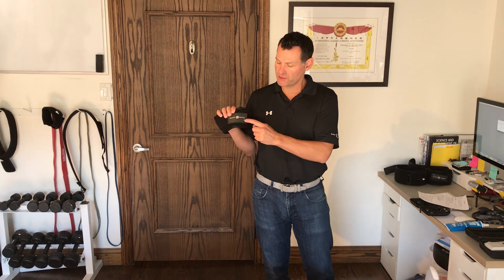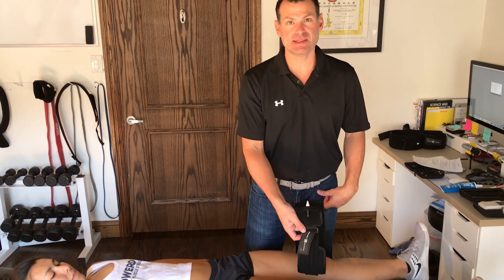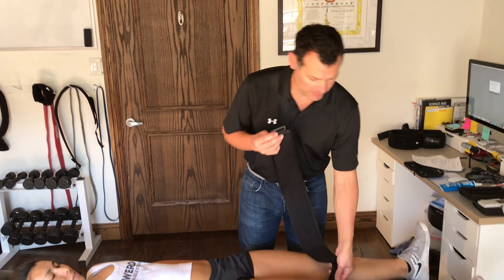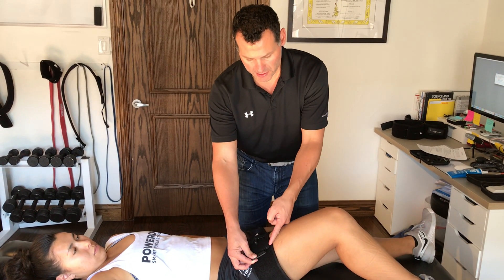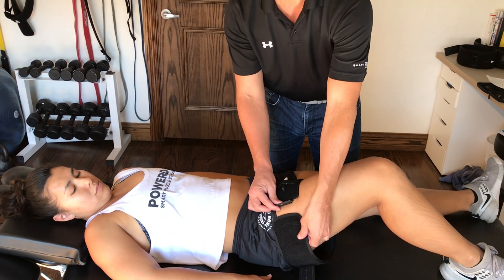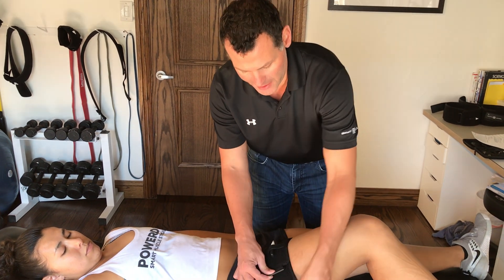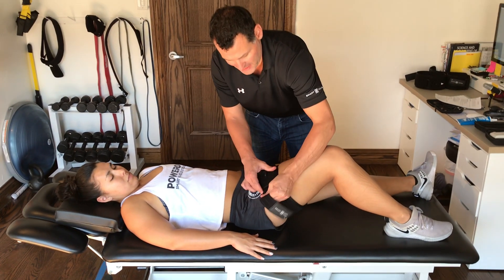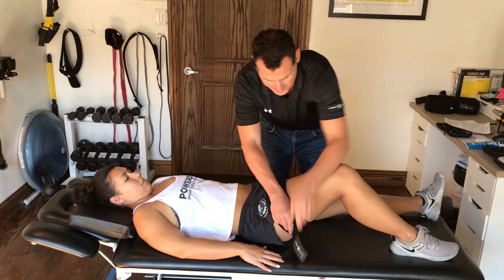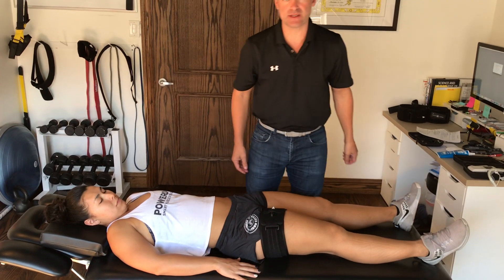On these cuffs you can see it's labeled cuff size 4. I want to make sure that the stem is facing me — that'll make it easier to inflate. I'm going to put the cuff on as high as I can and make sure there's a little bit of overlap. If the cuff was gapping, it would be too small and I wouldn't be able to get full occlusion, so I need to make sure it overlaps. I go through the D-loop, make it as tight as I can prior to inflating, and close it down. I let her lay flat with the stem facing me.